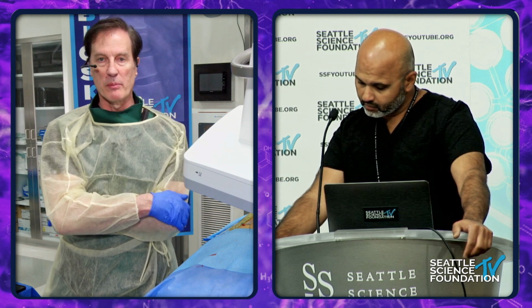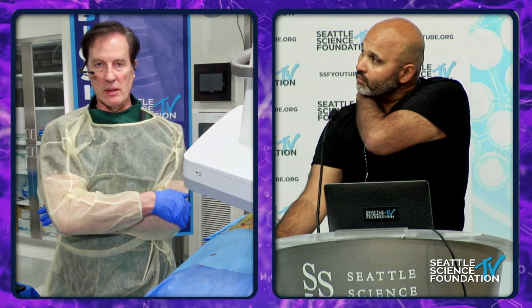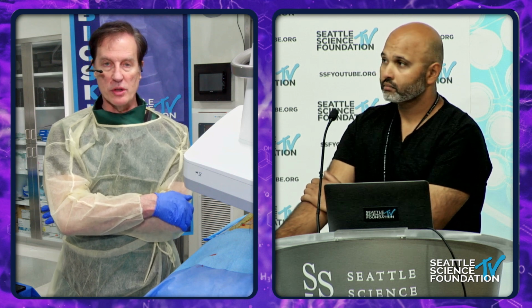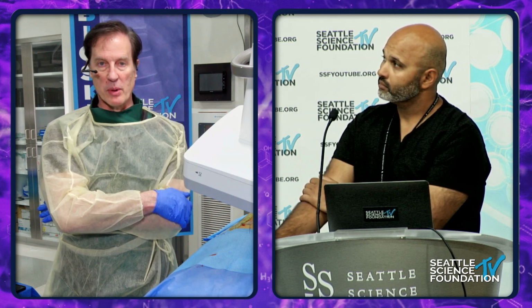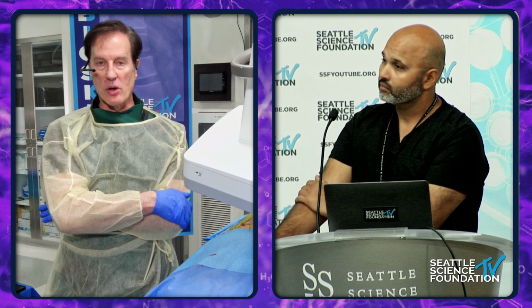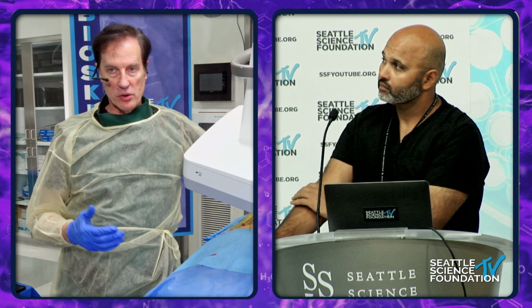I never just put 1 implant in. I always use 3 implants laterally or 3 implants posterolaterally. Most practitioners just do 2 implants posterolaterally. But most of the data, the level 1 data that we have, is all lateral implants. So we just completed trials using the Genesis.